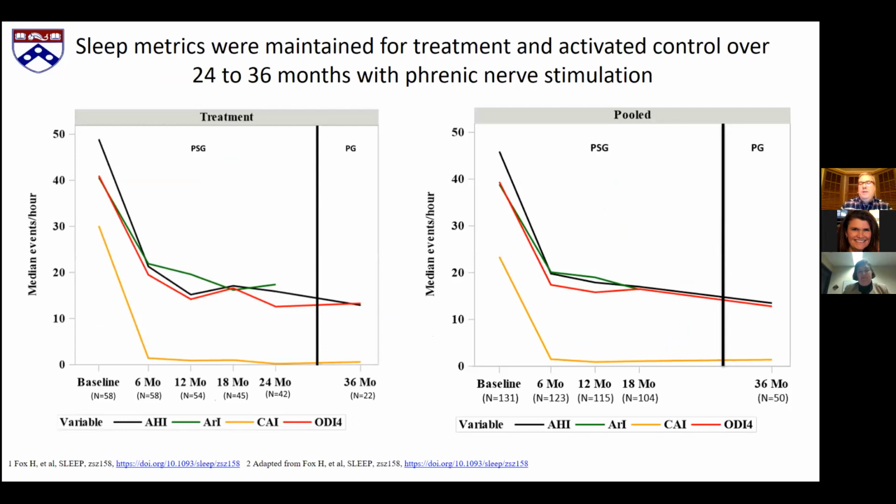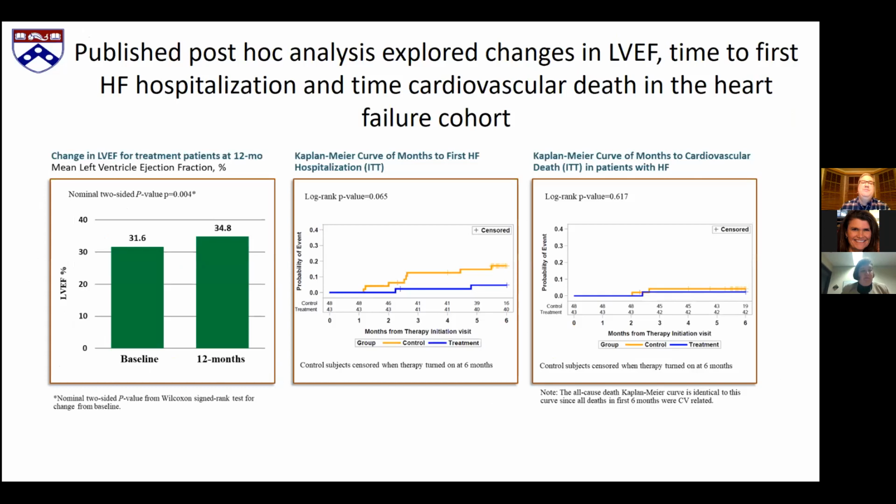You know, that's what we're hoping to see over time. And so knowing that the device, you don't lose the efficacy over time with phrenic stimulation, something that people were worried about based on older data, we certainly did not see with this device.